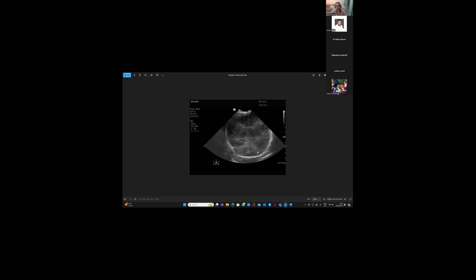So just for all of you at the back, that dark area at the bottom where your arrow is, that's the cisterna magna. Okay. Cerebellum with cisterna magna starting to come into view. So again, you basically have a moving baby. Just remember, if you freeze and you're getting an image that's blurred, move the ball. The ball will basically help to optimize images. But if you get an image like this, you almost will have to repeat it because you've got a significant amount of blurring on that left side. But well done. Amazing. Carry on.